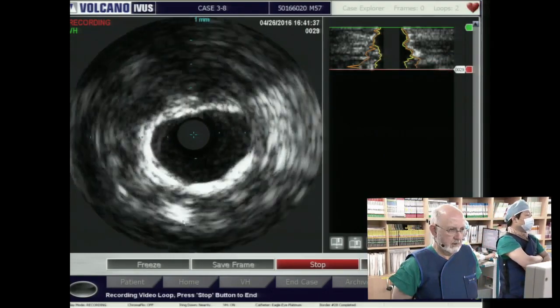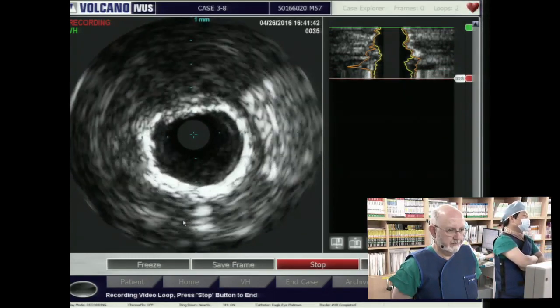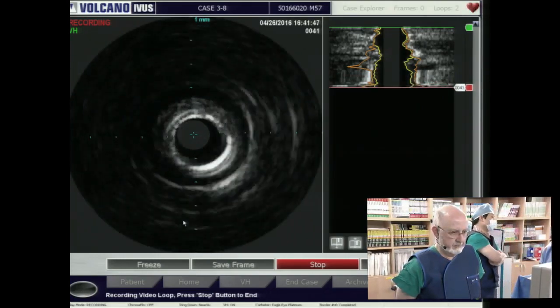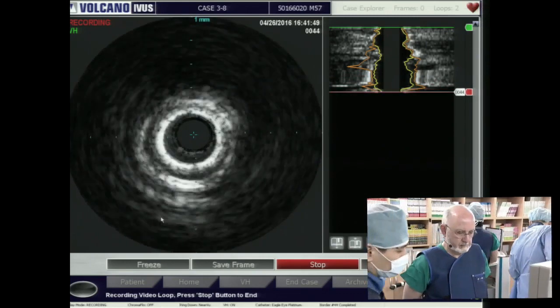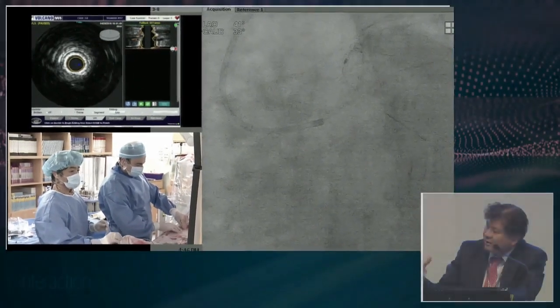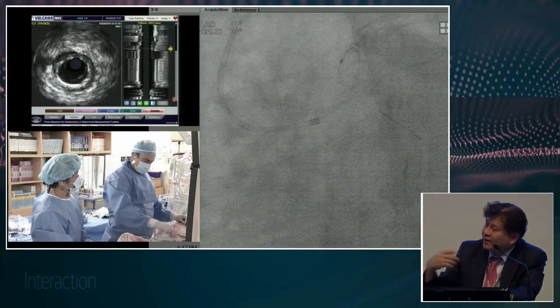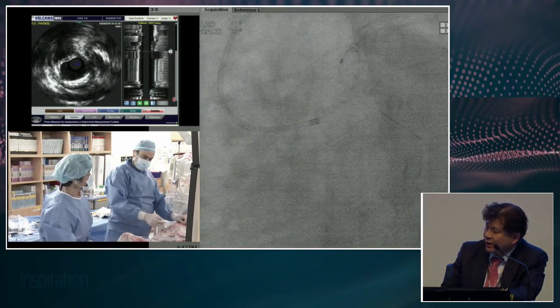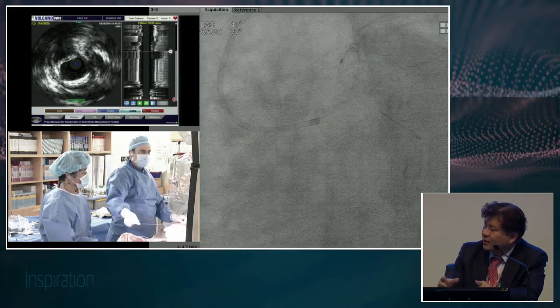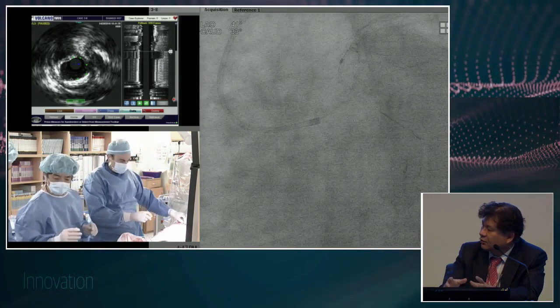In true bifurcation, the provisional concept is much better. Single stenting is not bad. If we look at that result, then we'll be fine. But personally, I feel that if there's some chance of disease progression in the circumflex, 65% or some future revascularization chance, or in the already stented area, the future TLR chance, in that case I'm routinely doing the kissing balloon. Otherwise, later on, we can turn single vessel disease into two vessel disease.